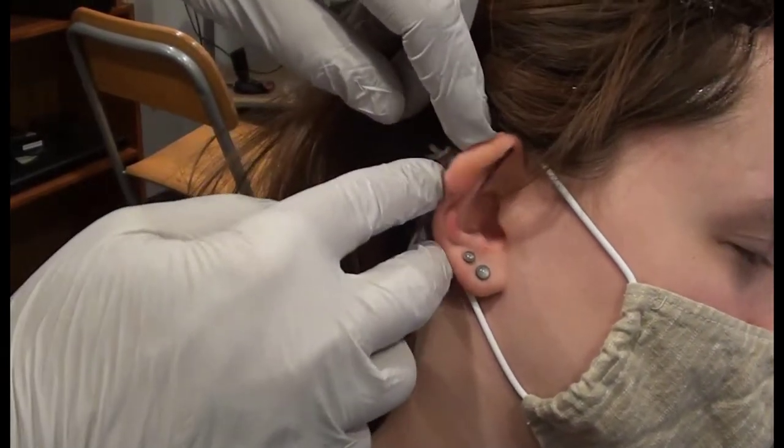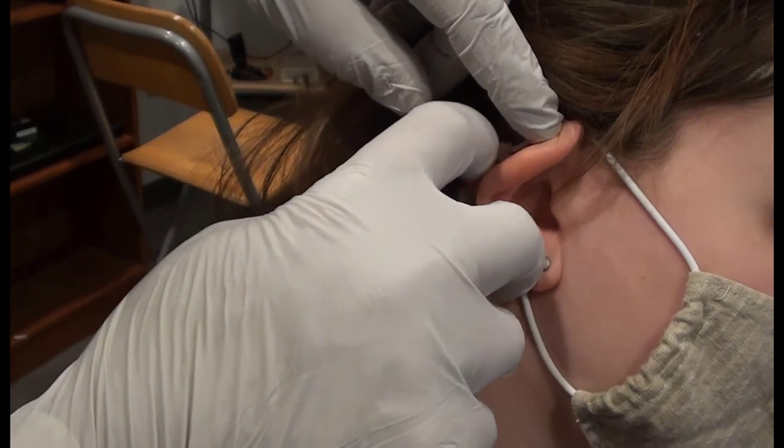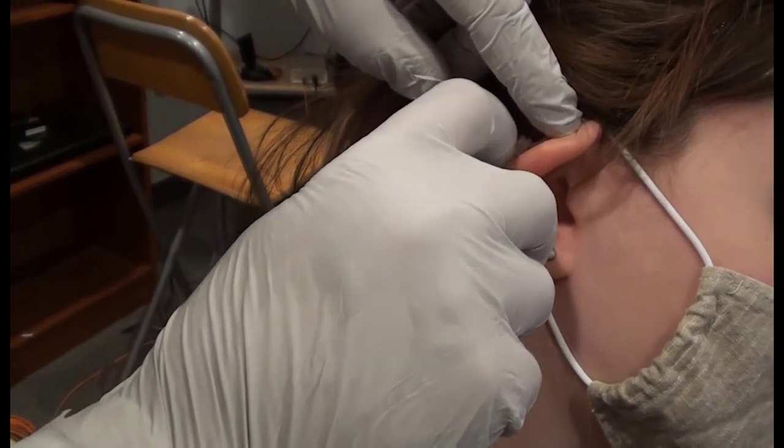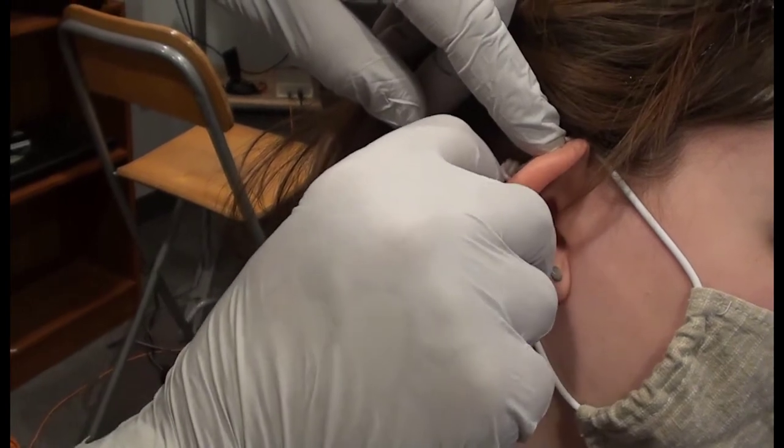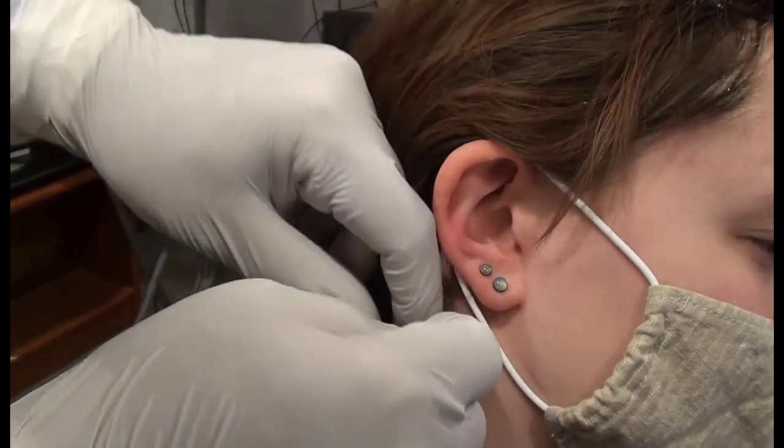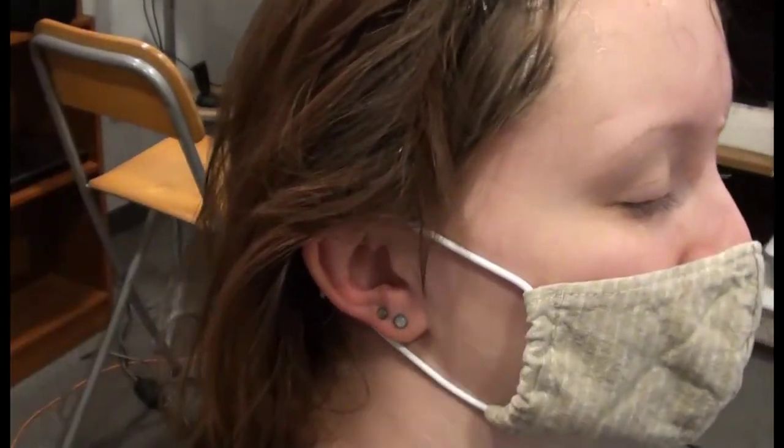Grasp the electrode at the top, distal end, and pull away from the head. Remove the double-sided adhesive ring from each electrode immediately to avoid these from getting stuck to other electrode wires. Note that waiting until you begin washing the electrodes to try to remove these would be a mistake because they become very slick and hard to grasp when wet.